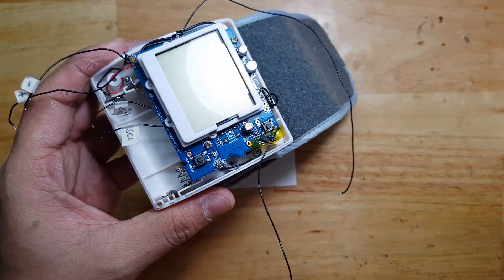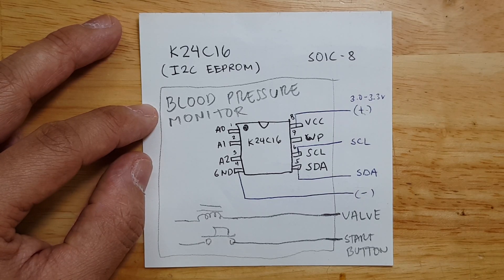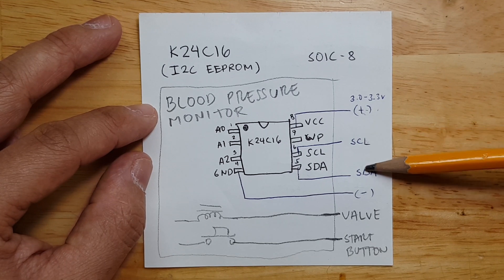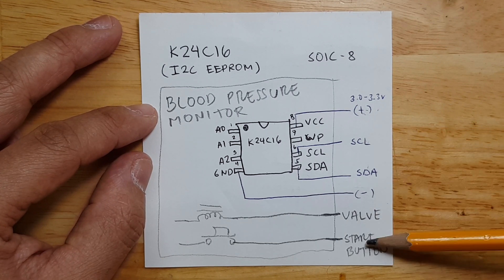So this is how it looks now. We have six wires: the positive, the I2C EEPROM, the negative, the valve, and the start button.